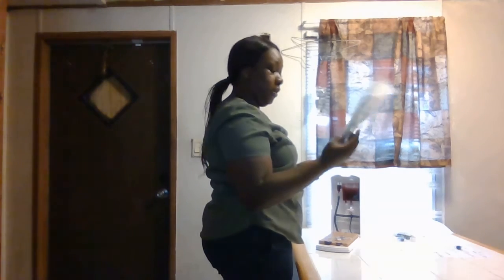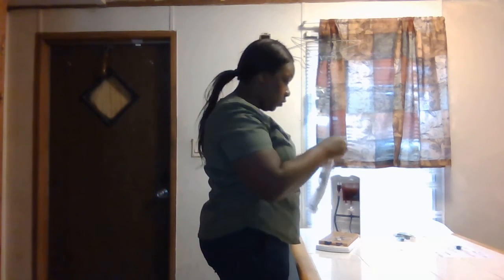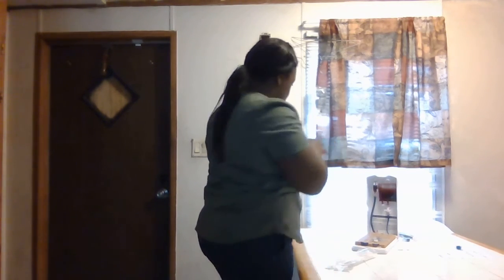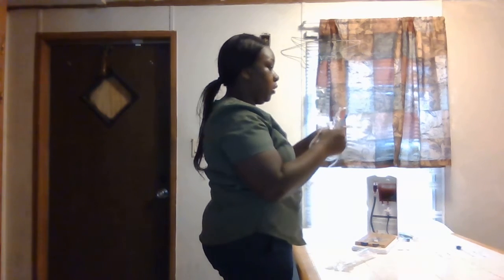Now I can get my primary tubing. Open it and again checking for any expiration dates, cuts, holes, tears, or wetness. And the first thing I'm going to do as soon as I open up my package is we're going to go ahead and close that roller clamp. Alright, so my roller clamp is closed. First thing you want to do is close your roller clamp.